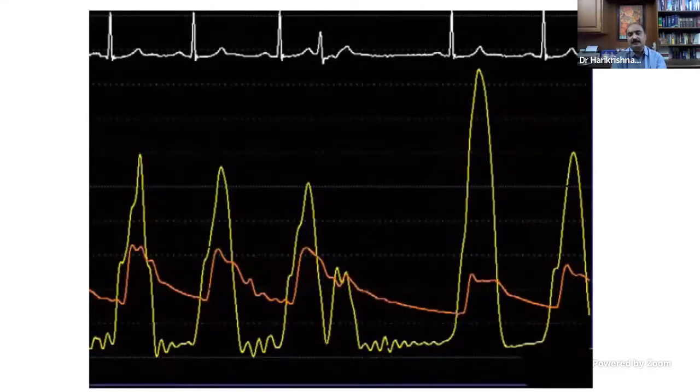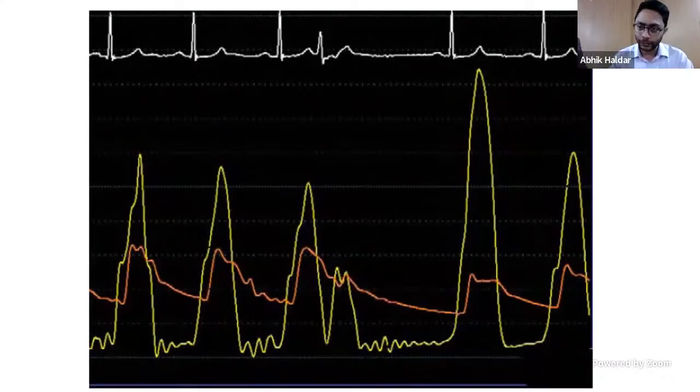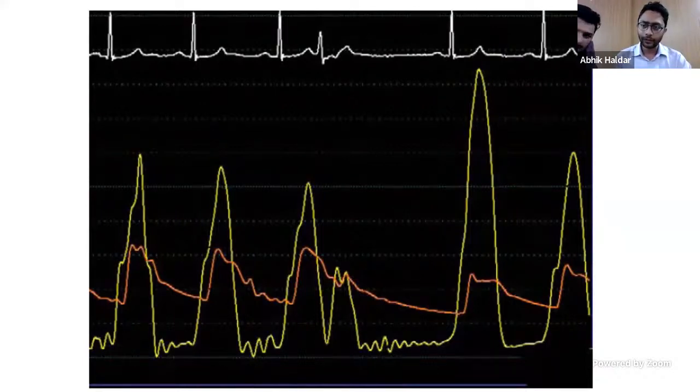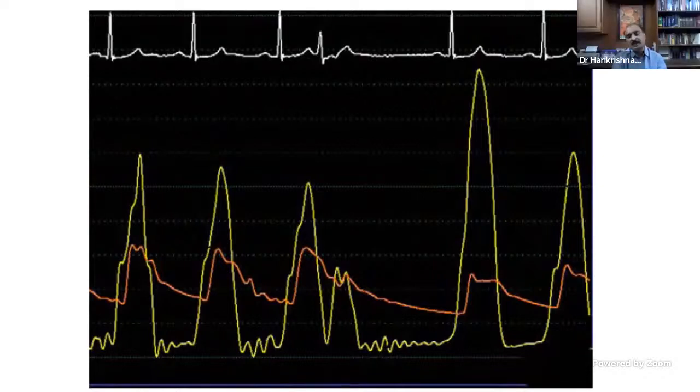So what is this one? This is the Brockenbrough-Braunwald sign. What is the reason for it? Sir, with increase in LV contraction, the outflow obstruction increases. It is a dynamic obstruction, so the cardiac output decreases and the peripheral BP falls. That is the reason for the decrease in the pulse pressure. So that is how you differentiate between a fixed and a dynamic obstruction.